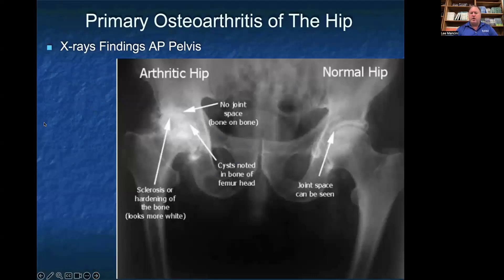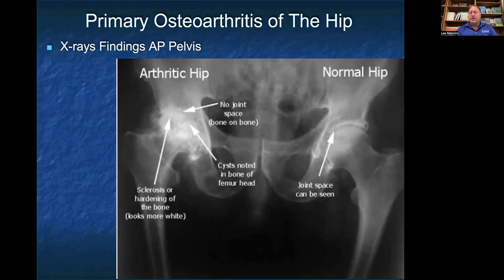For primary osteoarthritis of the hip, here you have an x-ray where on the right side of our image you can see a normal hip joint with good joint space between the head of the femur and the acetabulum, while on the opposite side you can see an arthritic hip. There are three main findings on x-ray: number one is decreased joint space between the head of the femur and the acetabulum; number two is cystic changes in the head of the femur; and number three is sclerotic changes in the bone where the two bones are pushing against each other, which looks brighter and more white than the normal side.